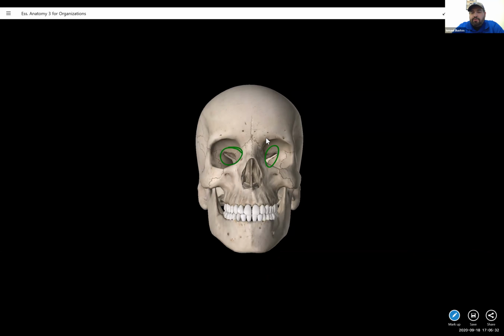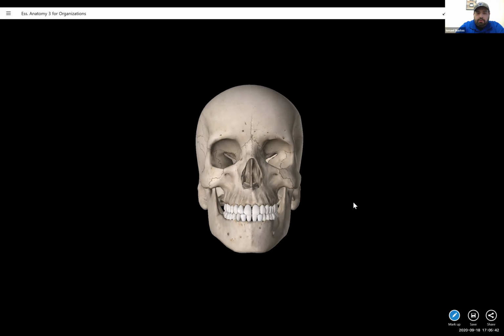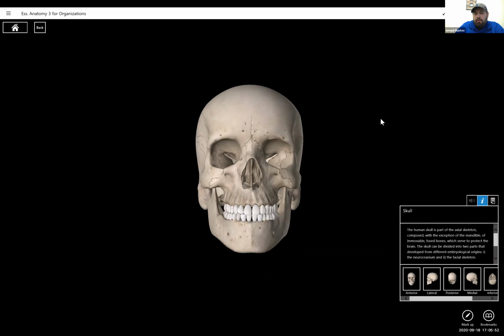That's what you will see with that 25 to 30 degree angle. And you'll also see, of course, what I just said: more of the orbits, the infraorbital margin of the orbits. Although it's distorted, you'll see them. Okay, back to the PowerPoint.